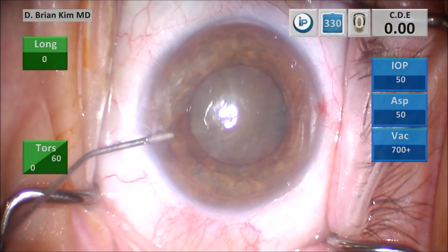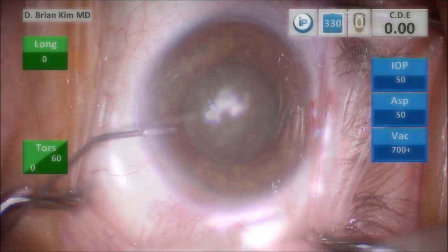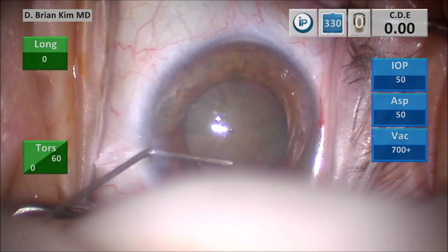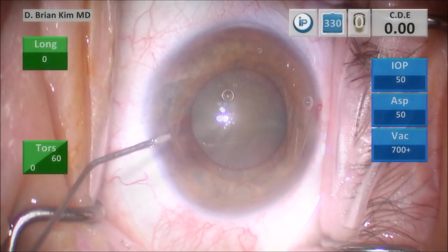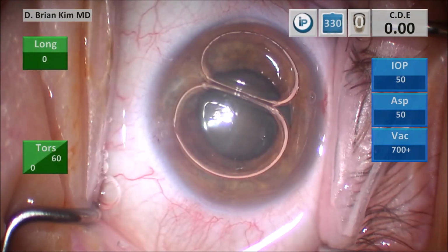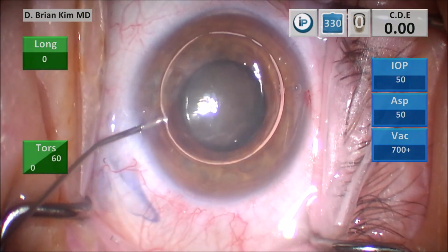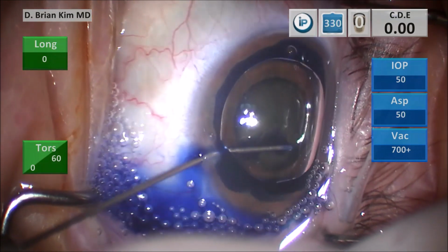I'm injecting some intracameral lidocaine and then some intracameral epinephrine. Anytime you have a really dense lens, you want to really get a nice sized pupil whenever possible. And I'm injecting some intracameral air and then now some trypan blue to paint the anterior capsule surface.